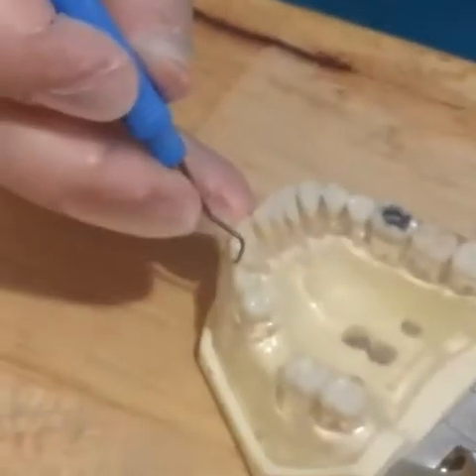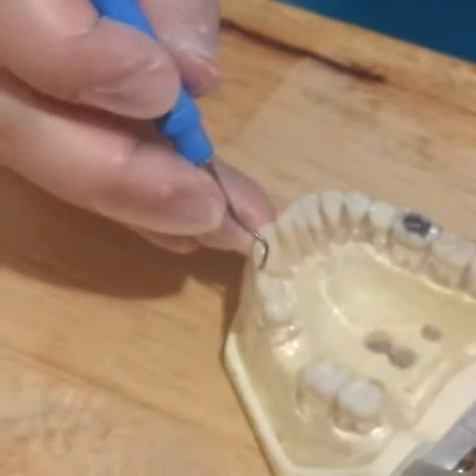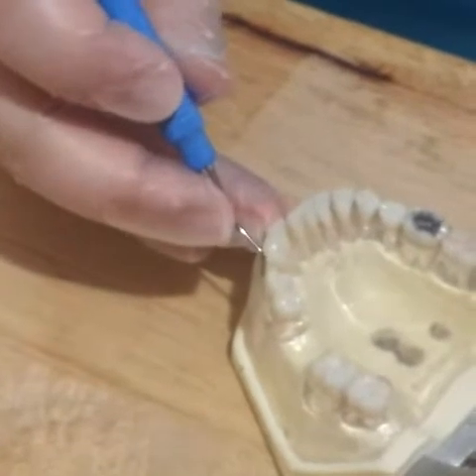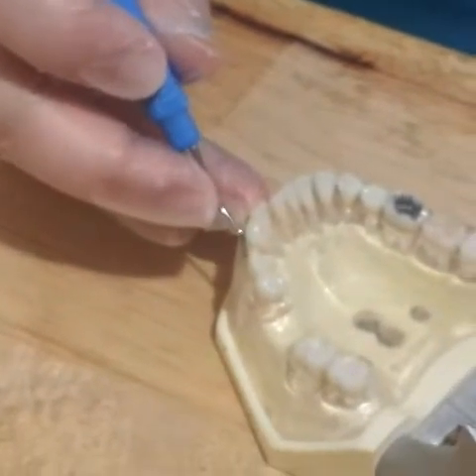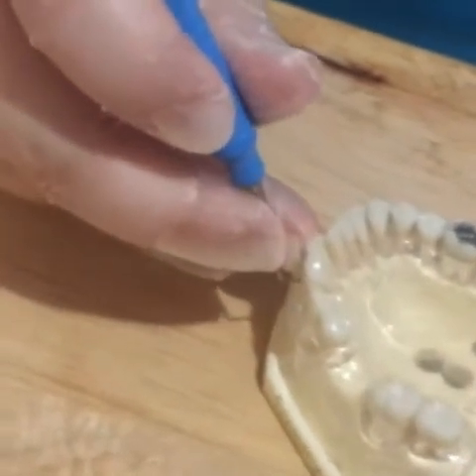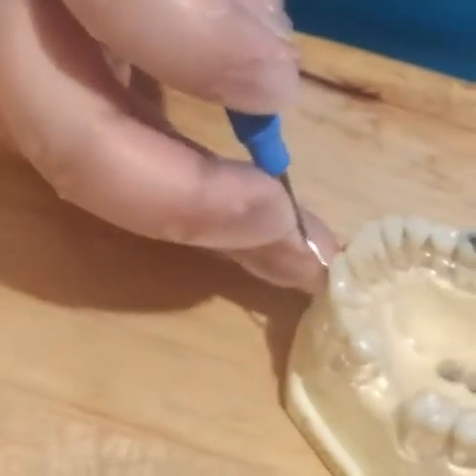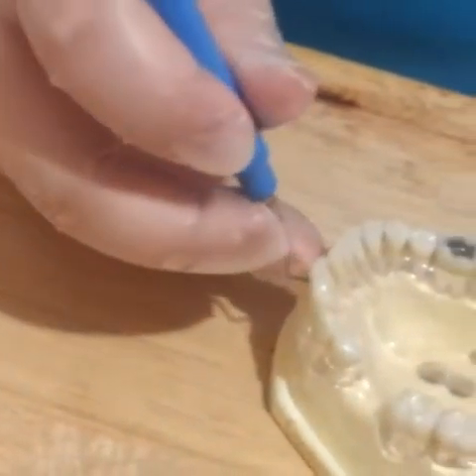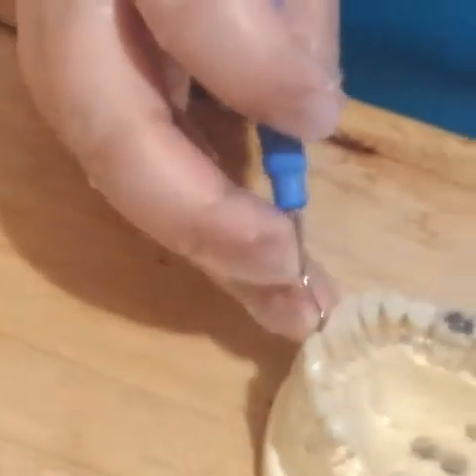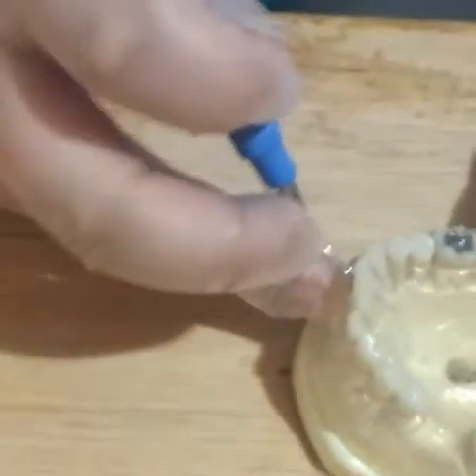When you reach tooth number 22, you will insert the toe of the instrument under the gingival margin, slightly distal to the midline of the tooth, and instrument mesially onto the proximal surface of the tooth. You will again instrument slightly lingual to the direct mesial of the tooth surface. Continue this technique across the lower facial anterior teeth through tooth number 27.